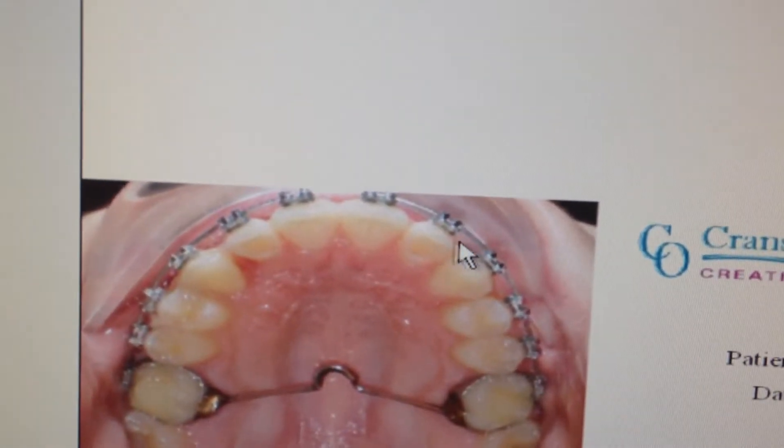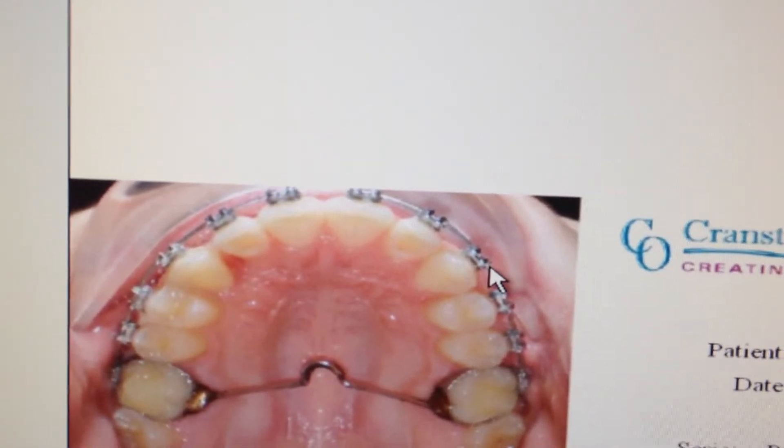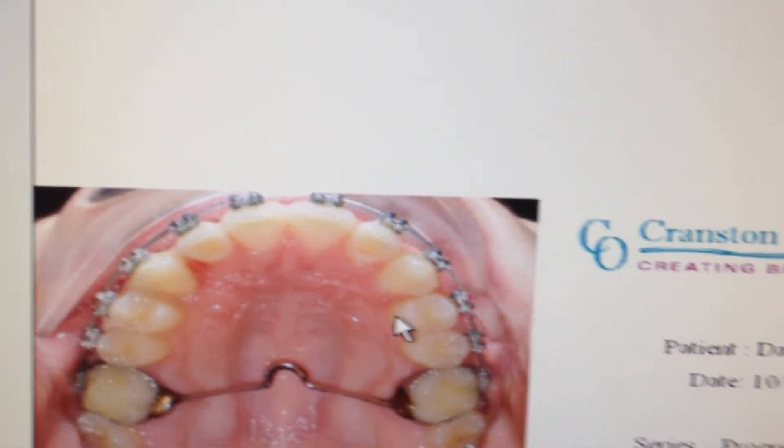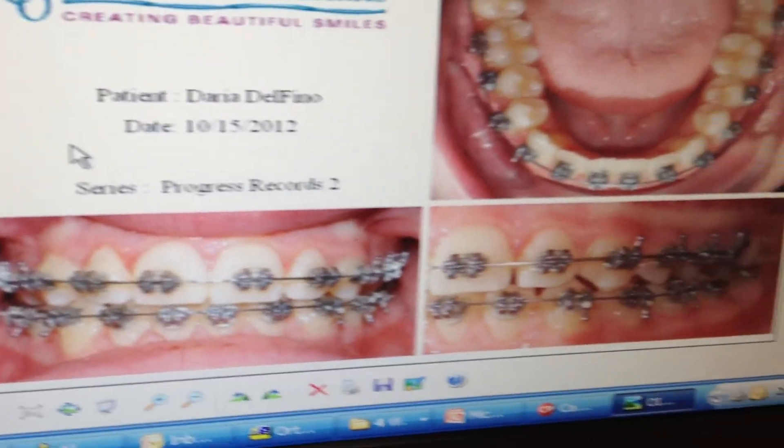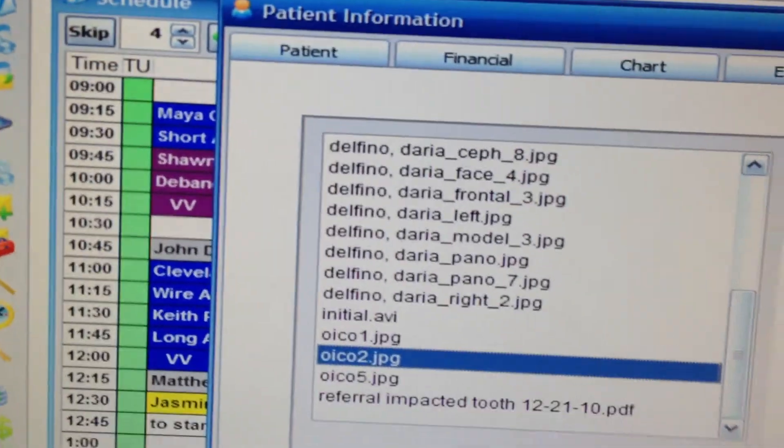This is a progress shot — you'll see that we pulled away and then directed it to the correct position. Here we are progressing well. We'll see another case next.